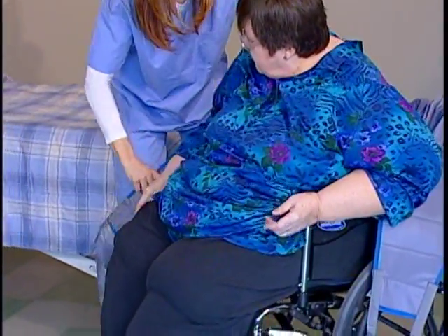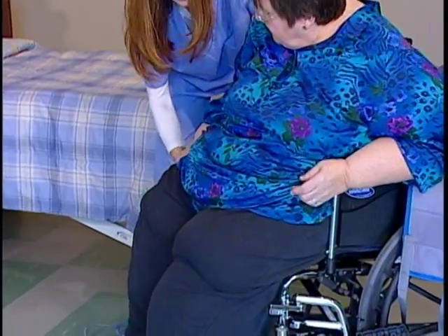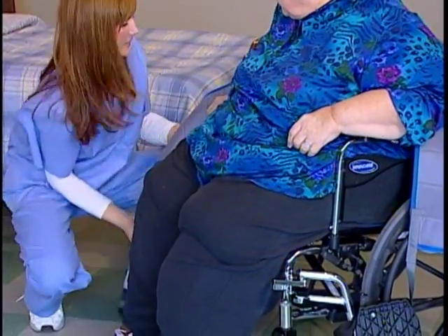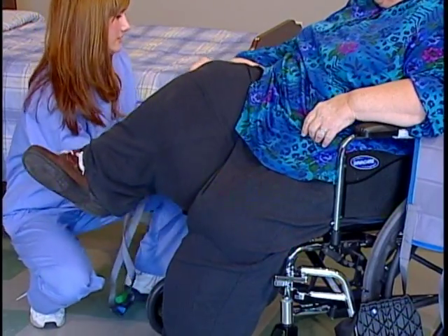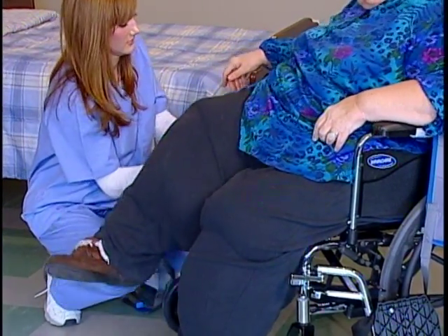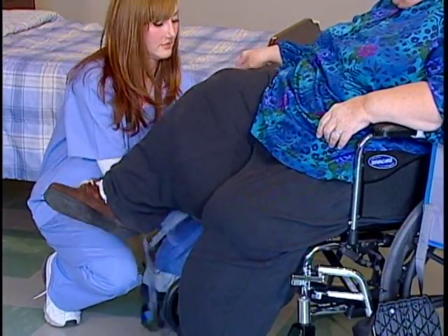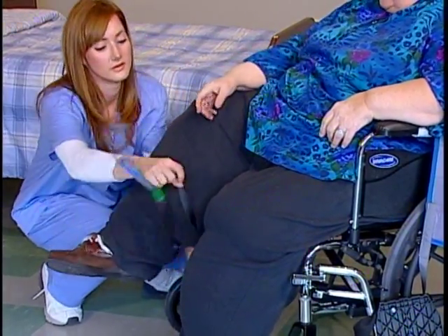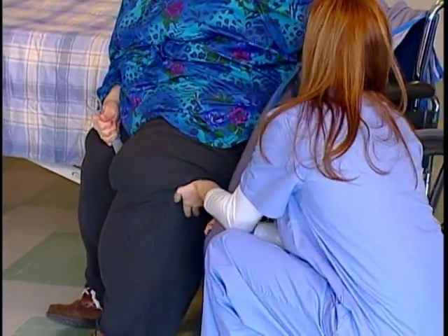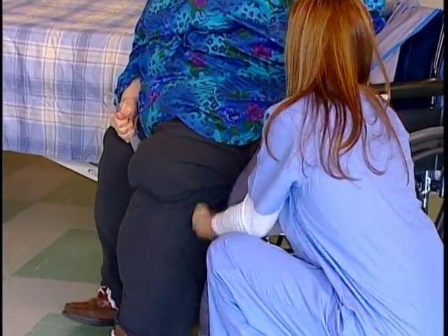Position the straps as far forward in the seat as possible. Lean the resident back into the wheelchair. Lift one of the resident's legs, reach under, and pull the sling out until it's just behind the resident's knee, about three inches. Repeat the procedure for the other leg. Be sure that the sling is clear of the wheelchair's front corners.